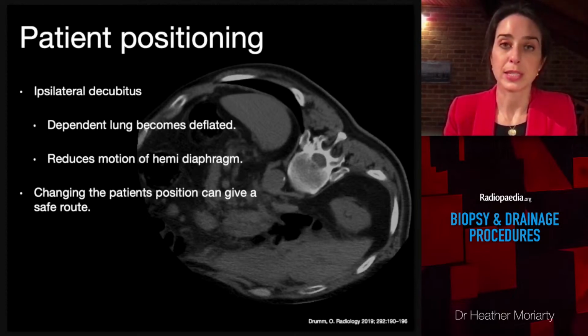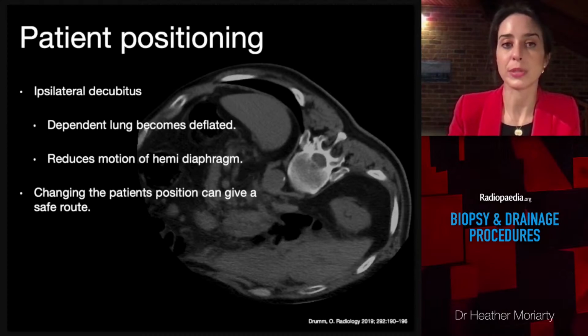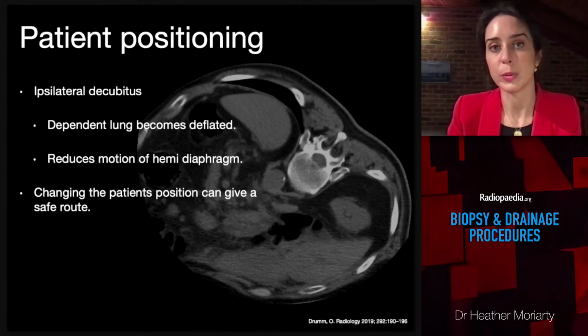Sometimes just changing a patient's position can move structures slightly, so think carefully about that for challenging procedures. It can, on occasion, convert an undoable procedure into an achievable one.